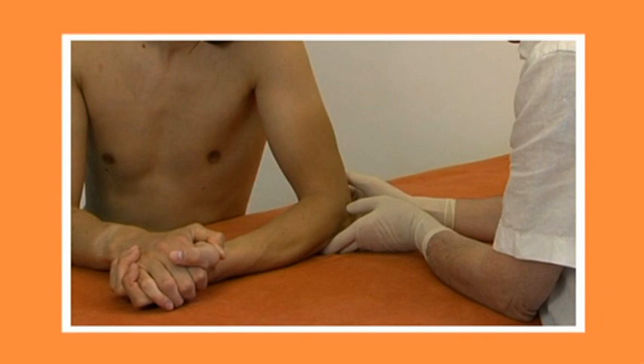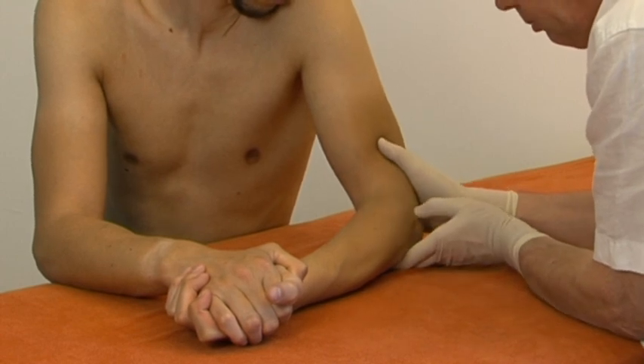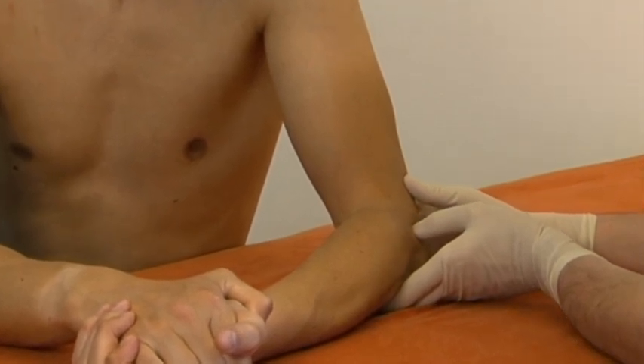The patient sits with his arm lying on the couch. His elbow is flexed 90 degrees, with his forearm in full supination. The therapist applies his thumb to the anterior aspect of the epicondyle, with his fingers on the ulnar side of the elbow, and ascertains the boundaries of the tender spot.